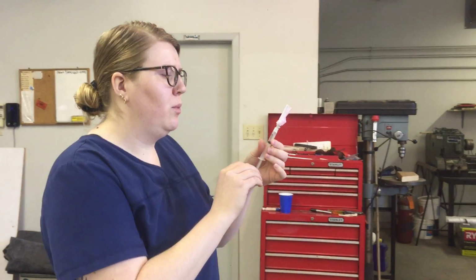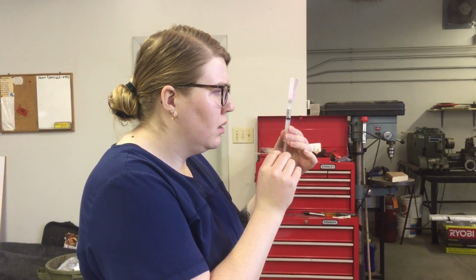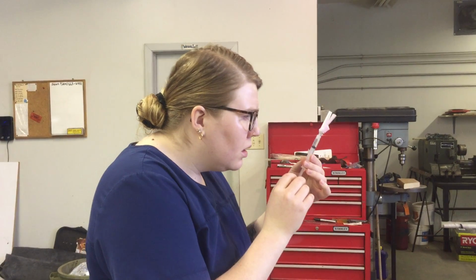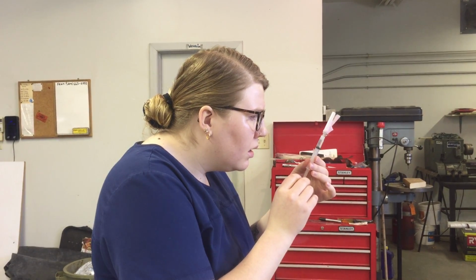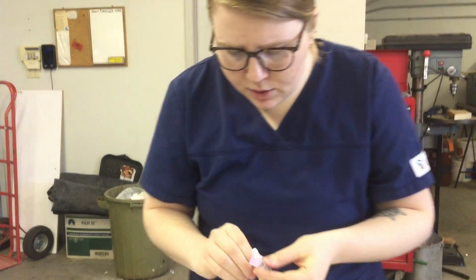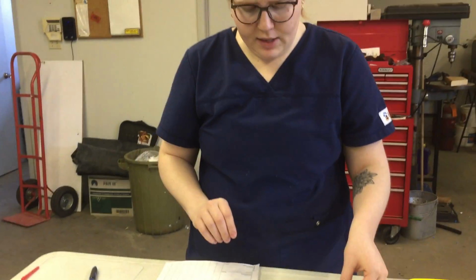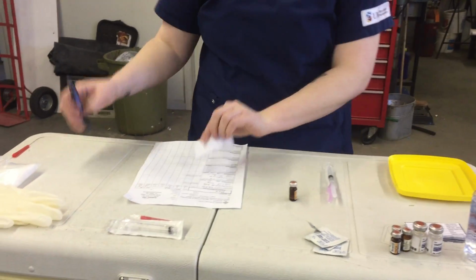So I'm going to be doing this over med waste, but at this point, I'm going to be calibrating to the right dose here. So once I've gotten the right dose and making sure that there's no bubbles, I'm just going to put this down so that you can see the right amount here. Good.